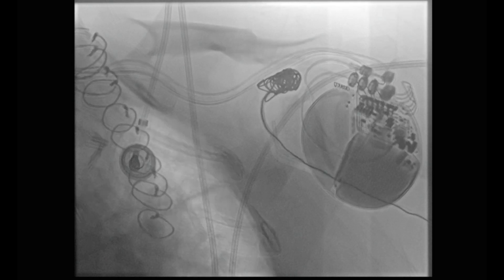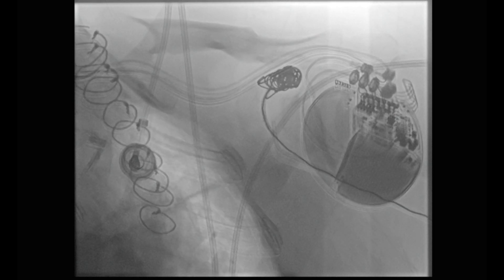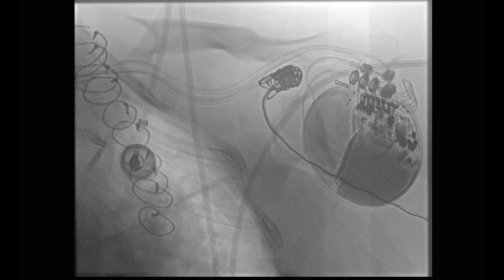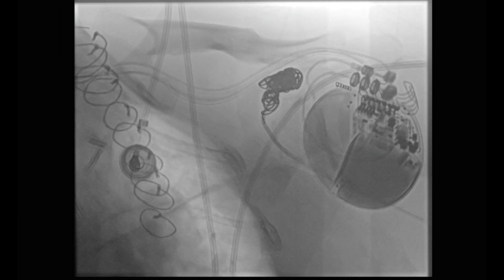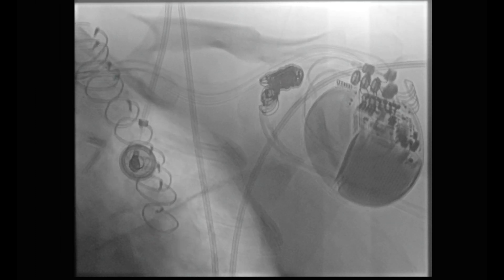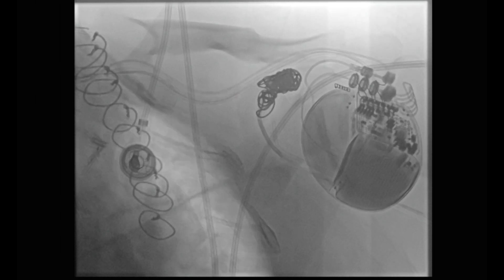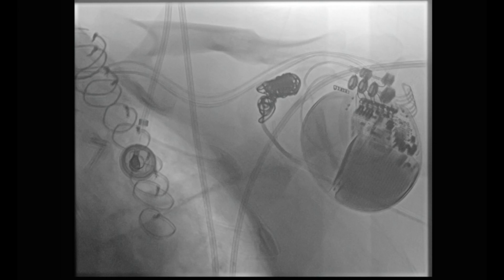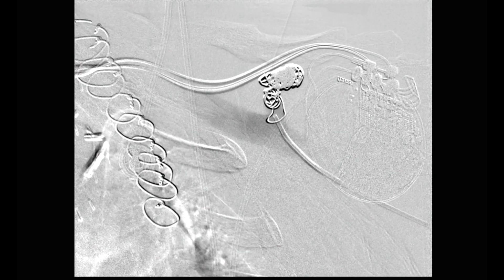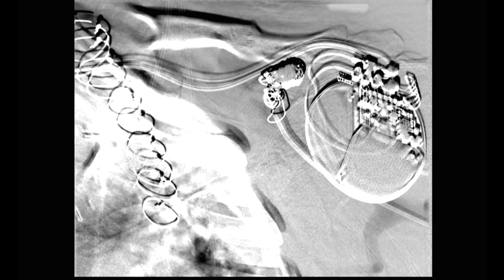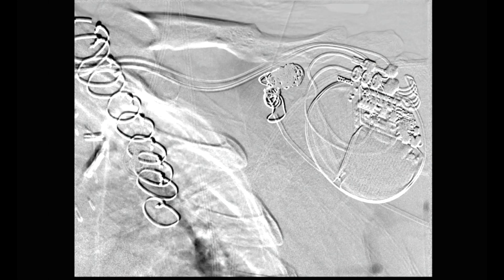Additional coils were deployed proximally. After that, a sufficient angiographic result was achieved with no sign of arterial to venous flow.